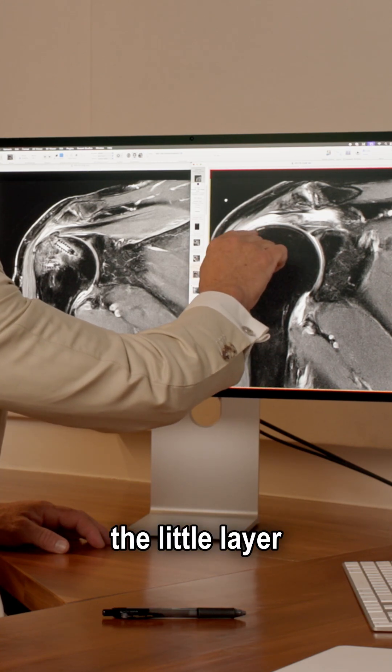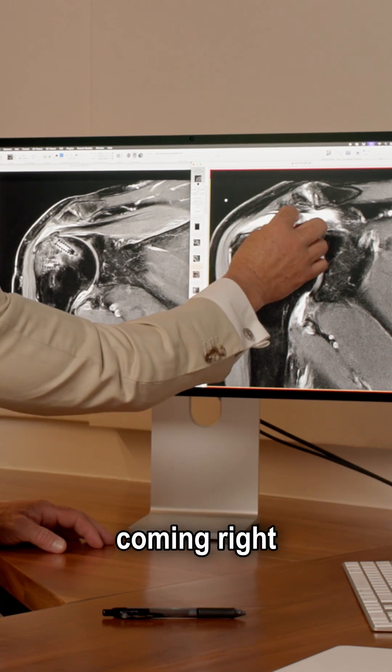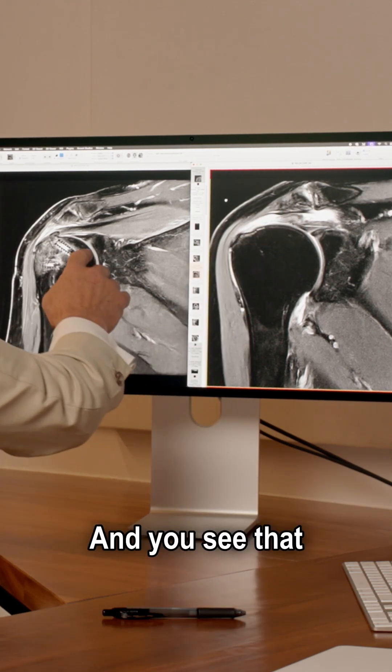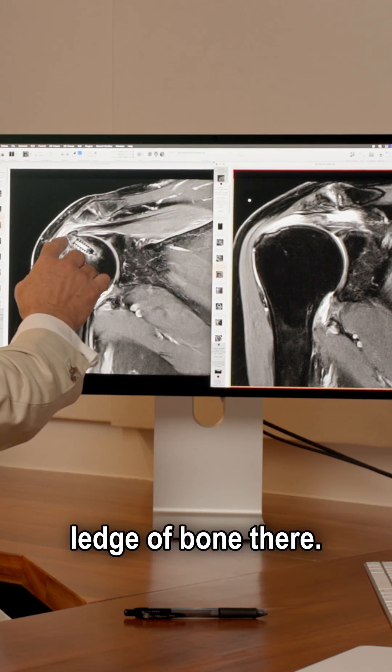This is the deltoid. This is the humeral head. There's a little layer of cartilage, and the white is fluid. There should be a tendon there coming right across the top there. And you see that here — this is post-op.